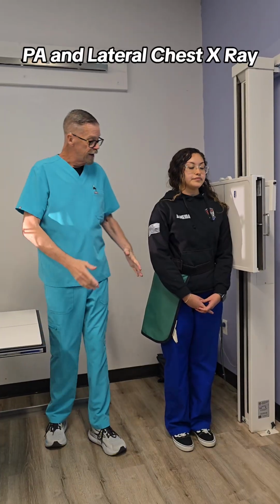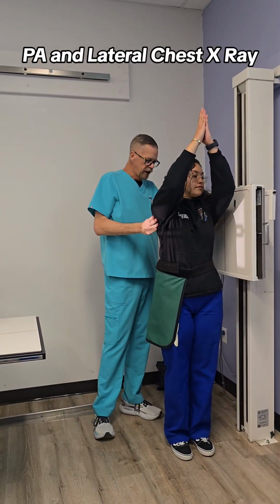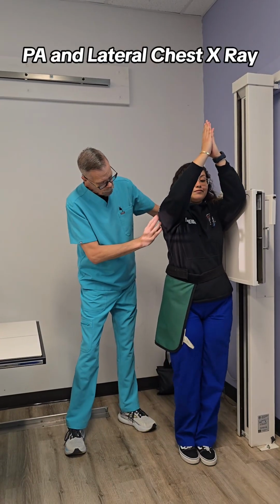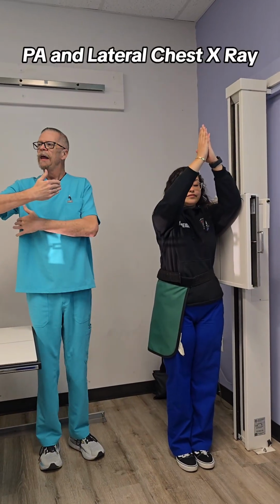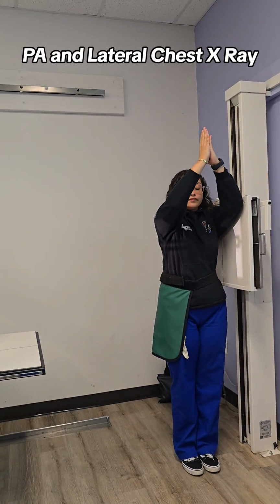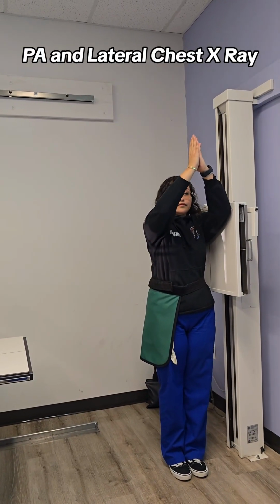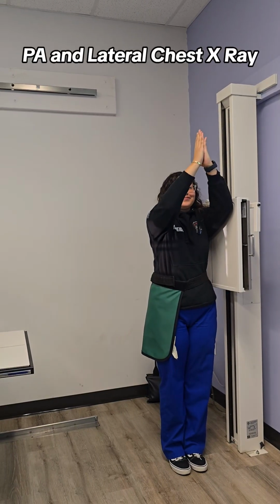So what body plane are we going to center our central ray on this time? Mid-coronal. Okay, so I'm going to have you bring both your arms up above your head. Take a little side step to your left. There we go. Right at that mid-coronal. So it's going to come in just a little bit under the axilla, still right at about the level of T7. Collimation, I can bring this side, front to back collimation, in because I see a lot of light. Top to bottom looks good from there.